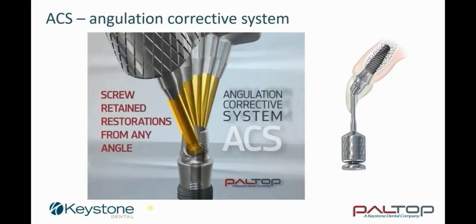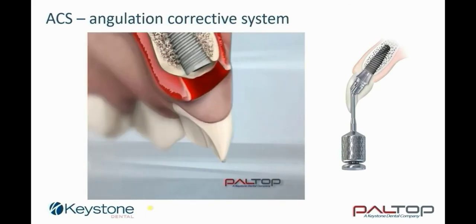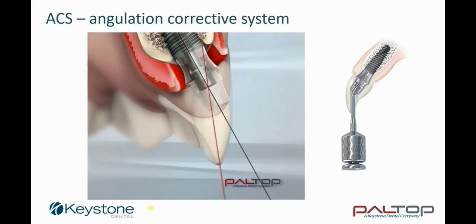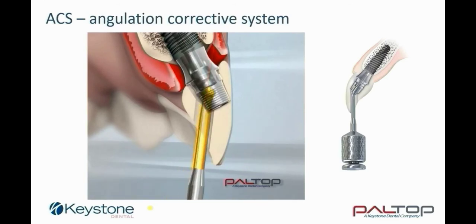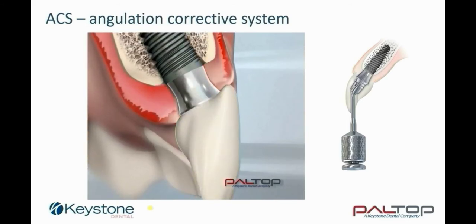The ACS abutment offers the dental technician control over the desired position of the screw access hole. This is beneficial, particularly in the anterior segment, to ensure the screw access hole is in the cingulum area without compromising the buccal aspect of the soft tissue, with the use of an angulated abutment.